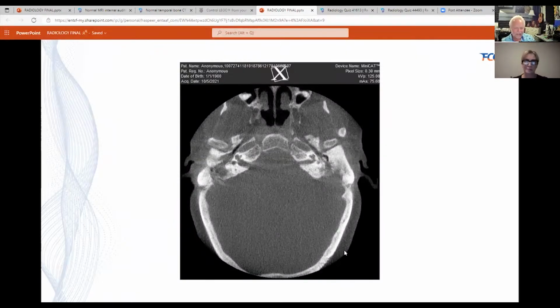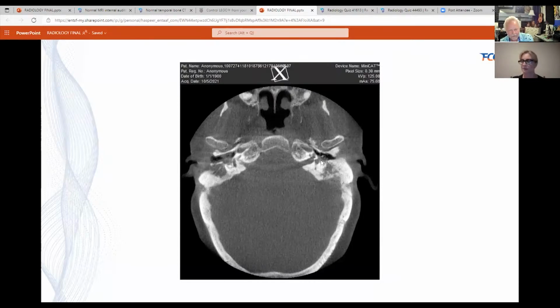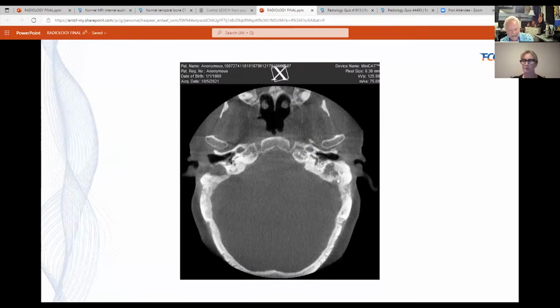Here's an example, again, of a CAT scan. This is that patient, and it shows the cholesteatomas. This is the right ear, and it shows that there is tremendous problems in the right ear, at least fluid and maybe a cholesteatoma. And then here in the left ear, you can see here's that ice cream cone, and this is cholesteatoma because there's bony destruction extending into the mastoid. As you come through, you can see it in the middle ear space. And this is the ear that's getting my attention first. And you can actually see the other ear had a previous surgery and is having problems again.